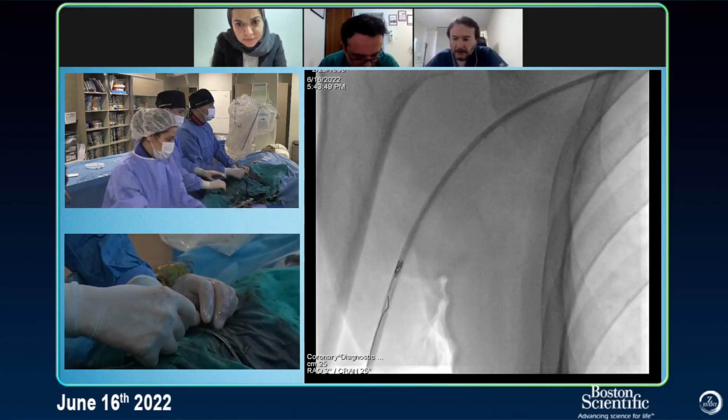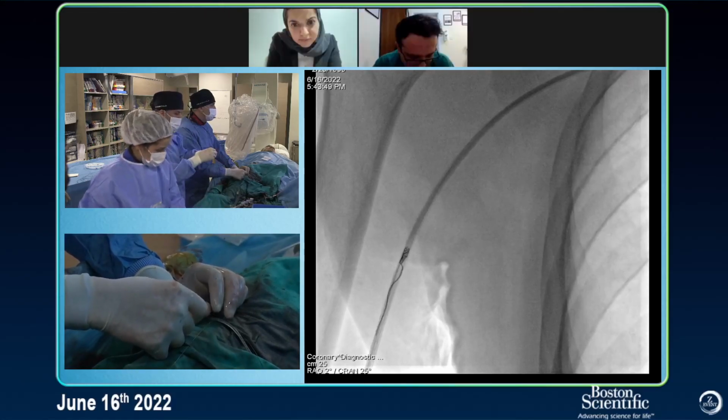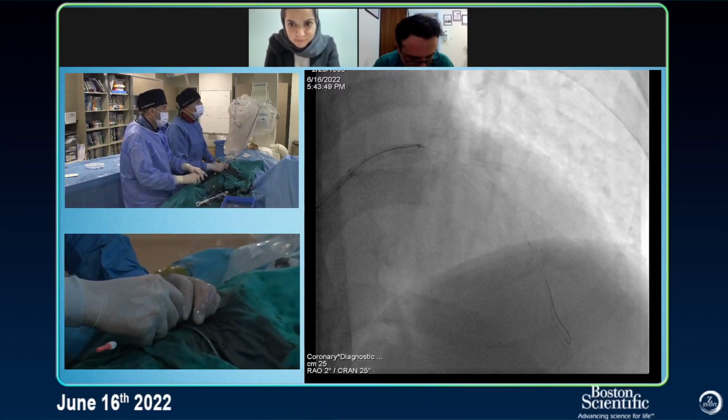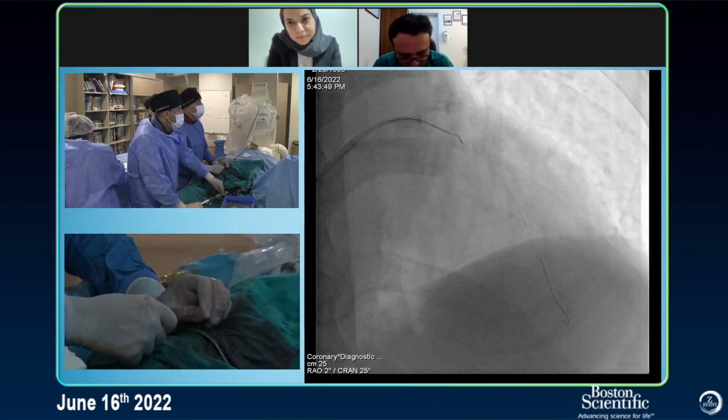Sometimes it's tricky. I know. Yes. Good. I think. Let's see. Okay. Yes. 2-0 balloon, please.